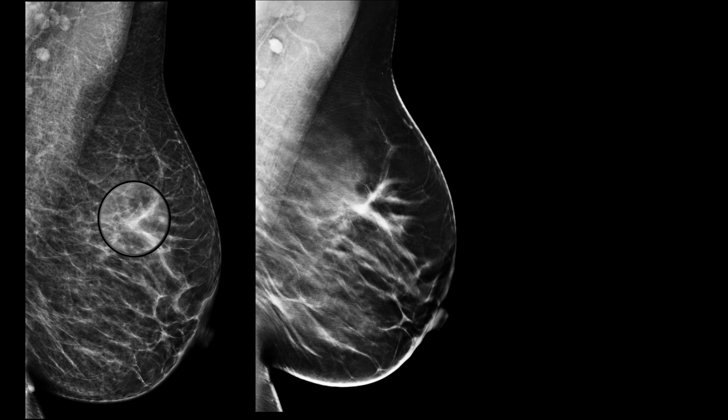Another example, in this case I'm going to show you an example compared to tomosynthesis. So not a dense breast, again. We see an asymmetry, maybe distortion, on the standard mammogram. Definitely we see that much better with tomosynthesis, excellent.